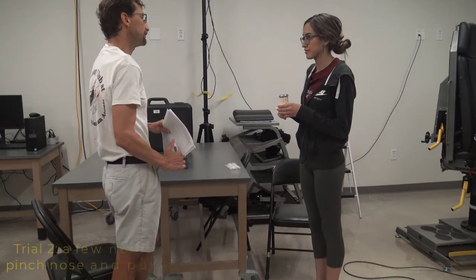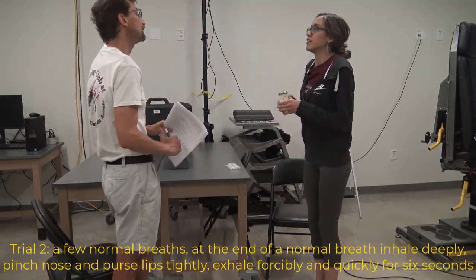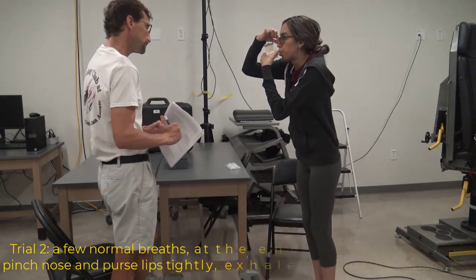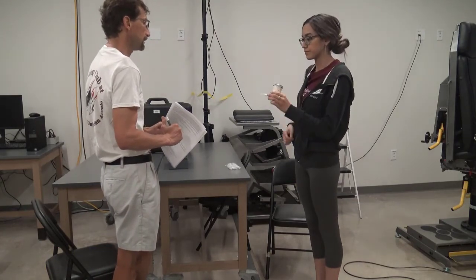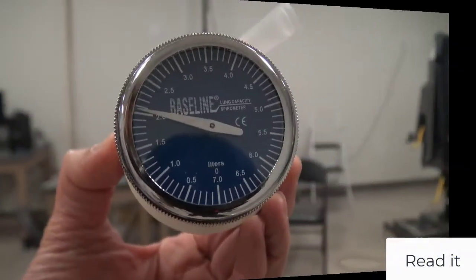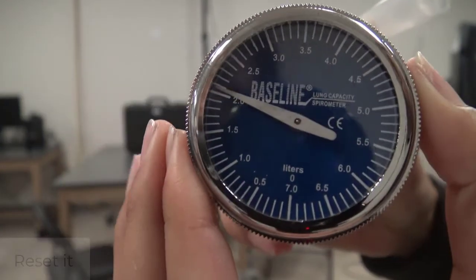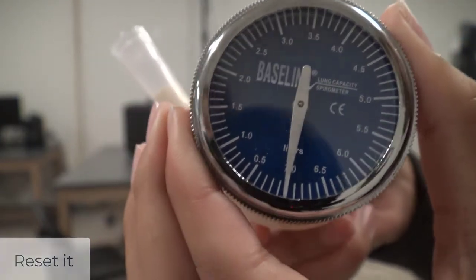So here we have trial 2, same thing, a few breaths and at the end of the last one, take a deep breath in, pinch the nose, purse the lips tightly. We don't want any air escaping from the nose or the lips. Blow as hard as you can for 6 seconds. Read that dial again. Looks like about 2.1 liters. Reset it to 0 for the third trial.